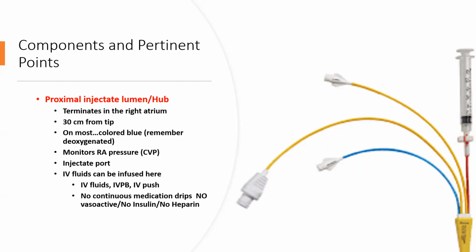Now, another question might be, could you infuse blood through this port? Or should you? For those of you who've used a pulmonary artery catheter, can you infuse or should you infuse blood through this port? Yes or no?